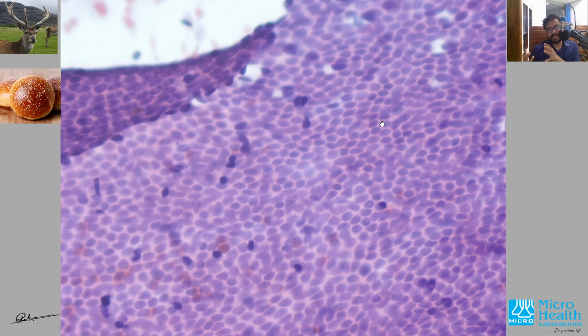So the ductal epithelial cell, as I told, fibroadenoma has an epithelial component and a stromal component. Unfortunately, in the slide, the stromal component did not come up. Only the ductal component has come up. So I'll be describing the ductal component. These are the very much cohesive ductal epithelial cells, and I can see it was very closely packed together. That's another feature of benign lesions, neoplasms in the breast.